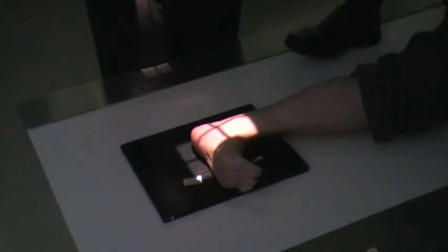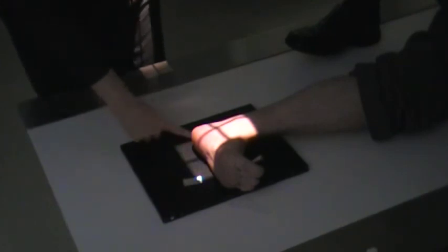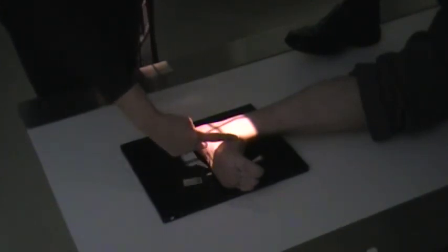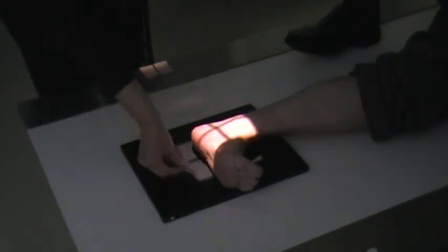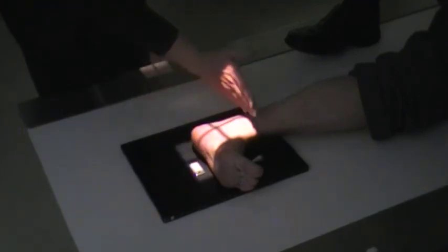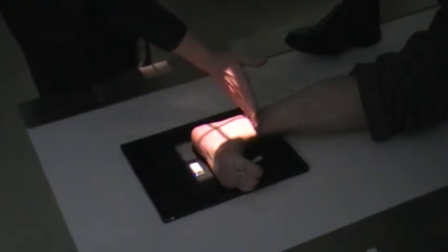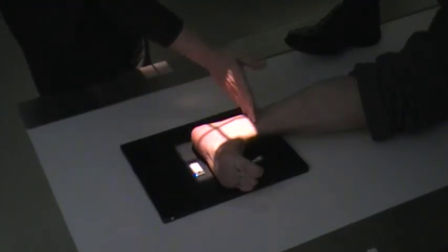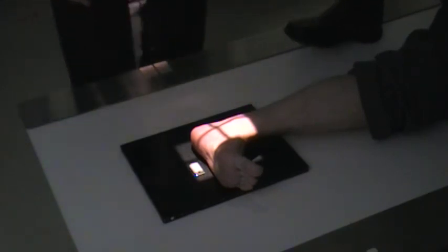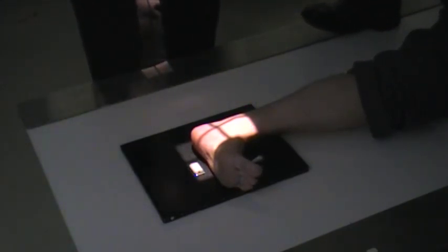We do not need to include the entire foot. Your central ray will include the very back side of the calcaneus and then halfway into the foot. Have your light above the malleolus here. We want to include the ankle joint as well. This is our lateral calcaneus.